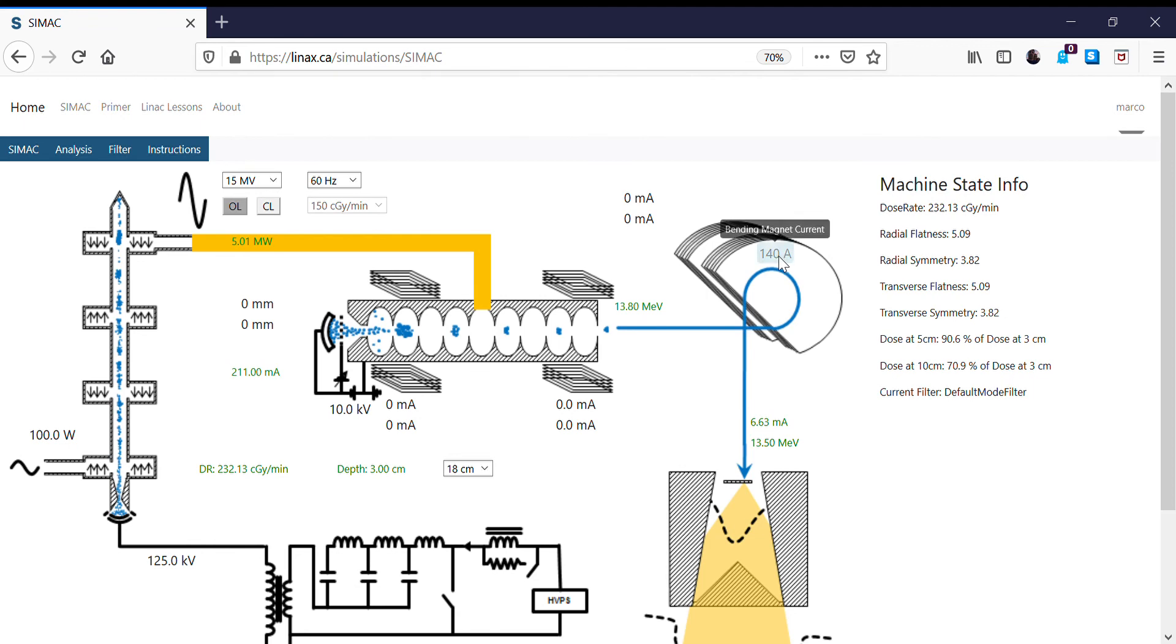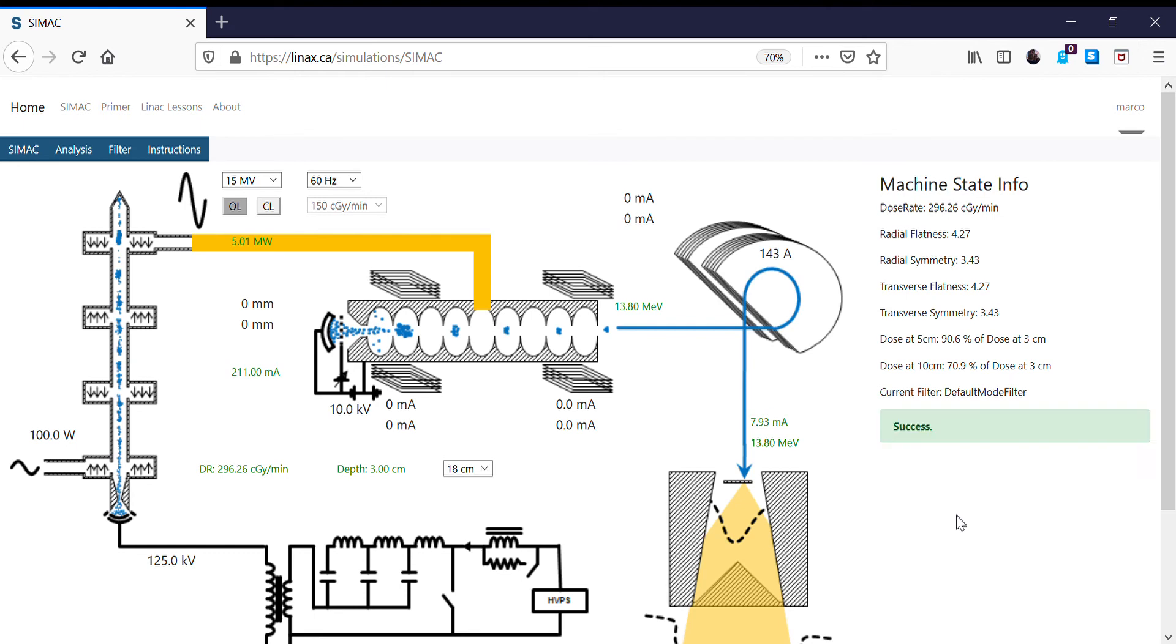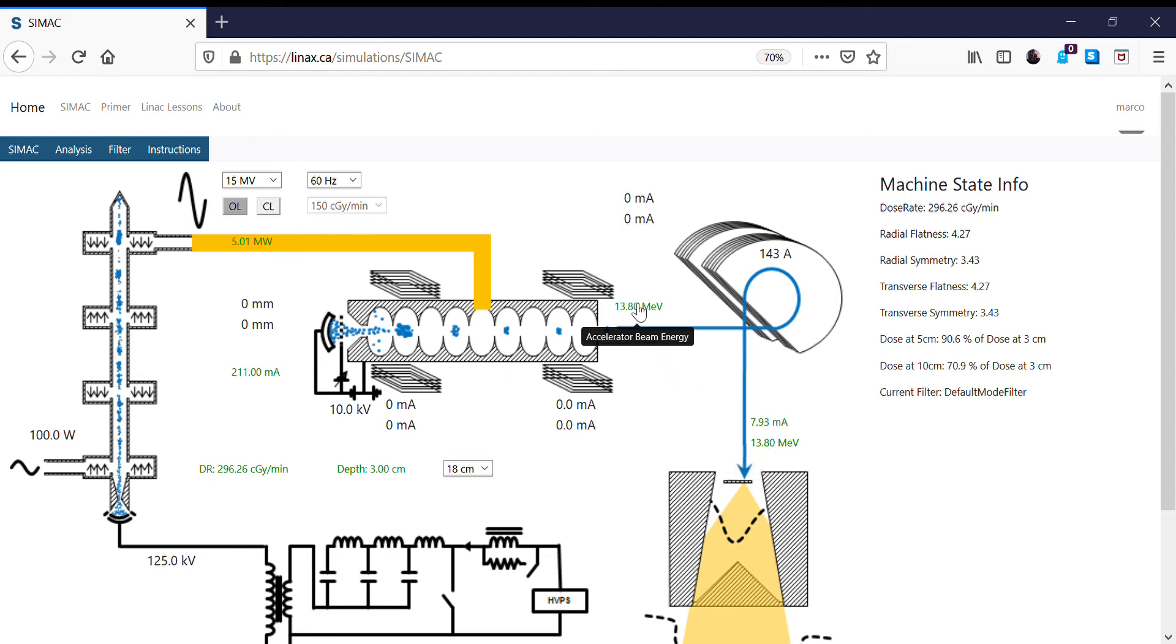So now I'm going to increase this to see if I can match the beam energies. So at 143 amps in the bending magnet, we have a beam energy of 13.8 MeV striking the target, which matches the beam energy of the electrons leaving the accelerator. We have a very high target current and we have a very high dose rate.